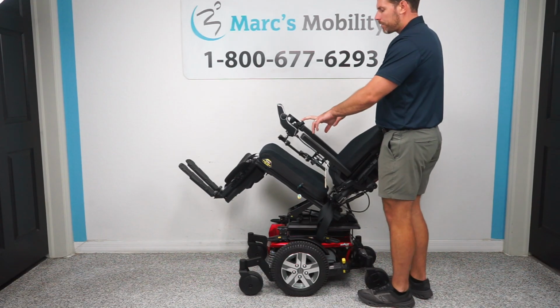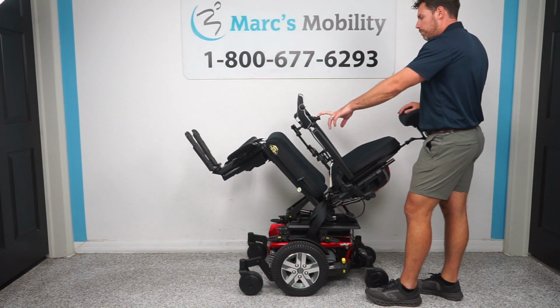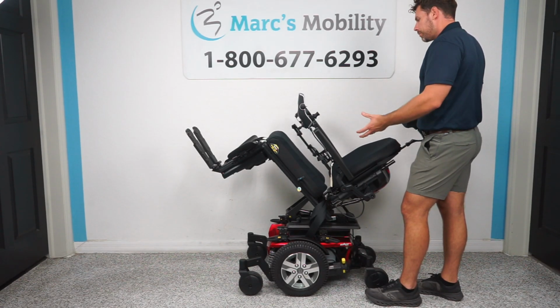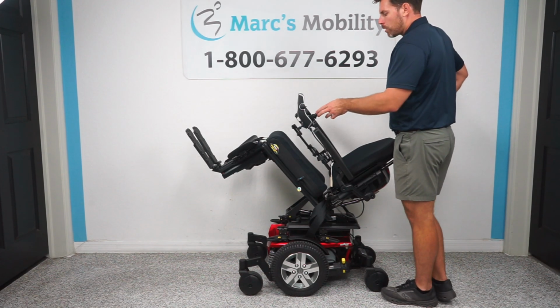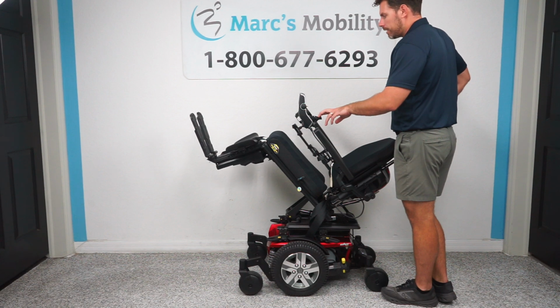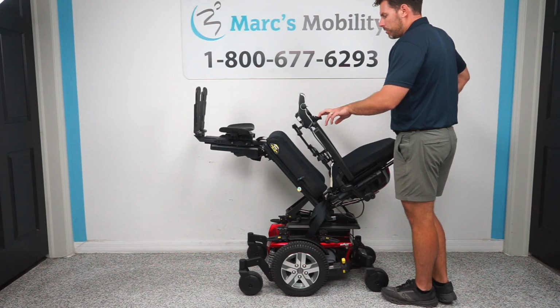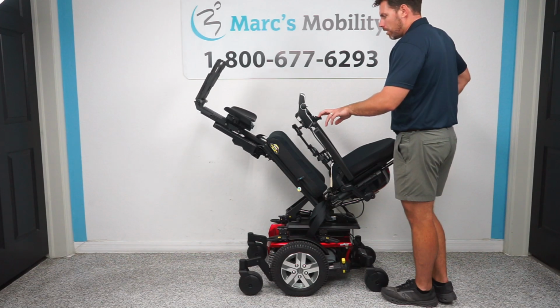This is probably the most medically necessary function on a chair. It's going to take the pressure off your lower half, apply it to your back with gravity, and what that's going to do is help with circulation and blood flow to the lower half of your body. So whether you have potential pressure sores or different types of circulation issues, this would assist with that. While you're in the tilted position, you are able to also elevate your legs, as you can see them here going up. So some people need to get their feet above their heart for periods of time. So this is also going to help increase that type of circulation throughout the lower half of your body, right here by having your legs above your heart.